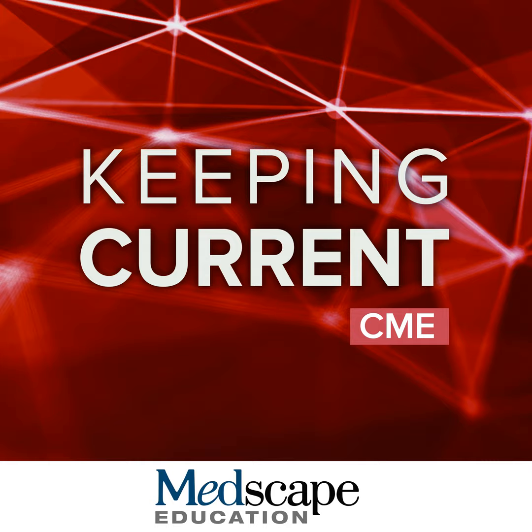Personally, I really find using the hepatobiliary phase beneficial in looking at neuroendocrine mets. These are cases just from UCSD on patients who have metastatic neuroendocrine tumors. If you look on your top left, we see a small little subcentimeter hepatobiliary defect in the right hepatic lobe. On T2, it's almost occult. We didn't see anything. On contrast, arterial phase, portal venous phase, didn't see anything, but then it was bright on the diffusion-weighted image.